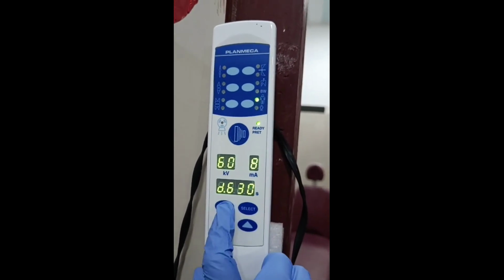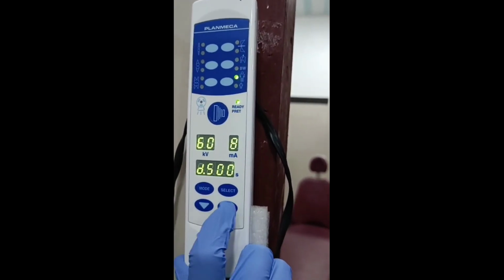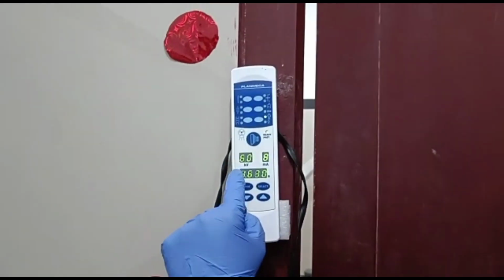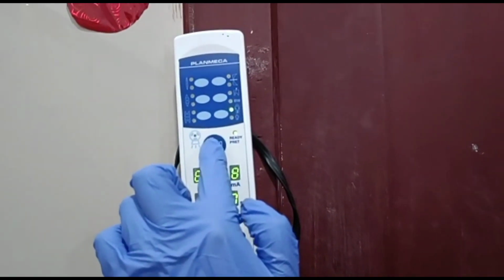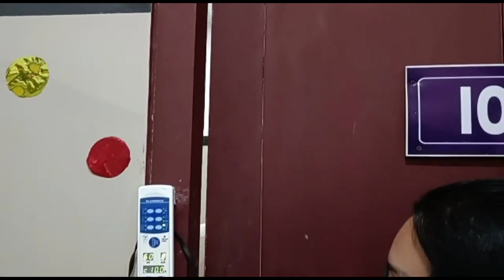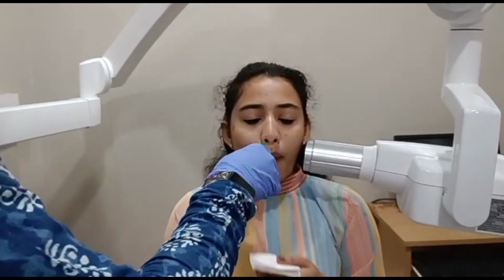Now I have reduced it. After adjusting the exposure parameters, we press the exposure button, and when the noise stops, you release your finger from the exposure button, and thus you've taken the image. The latent image has been captured on the X-ray film receptor.